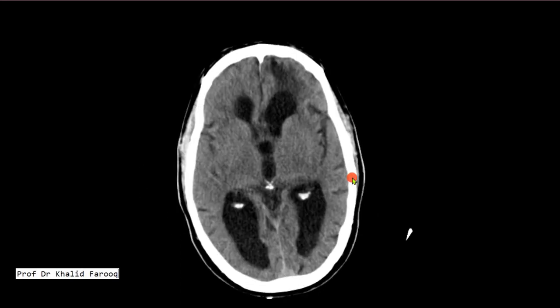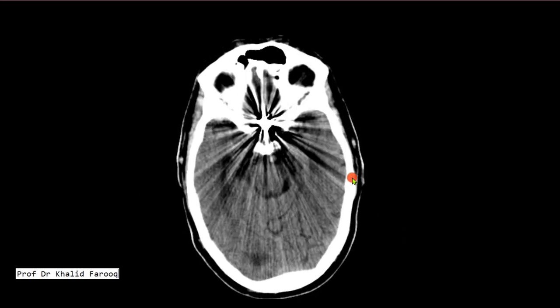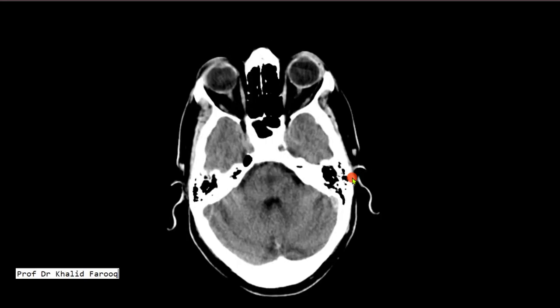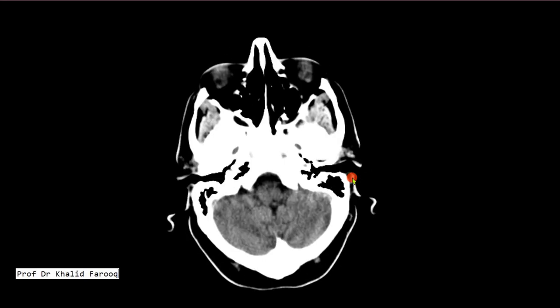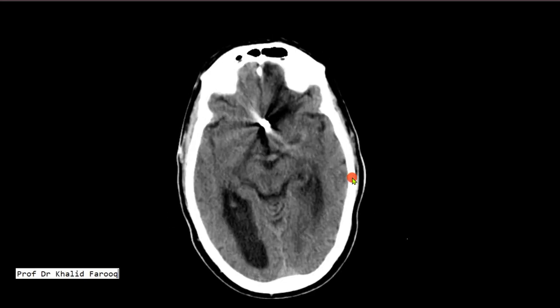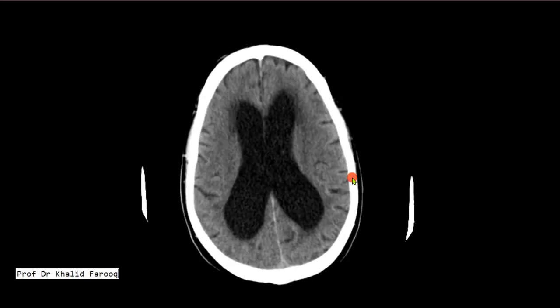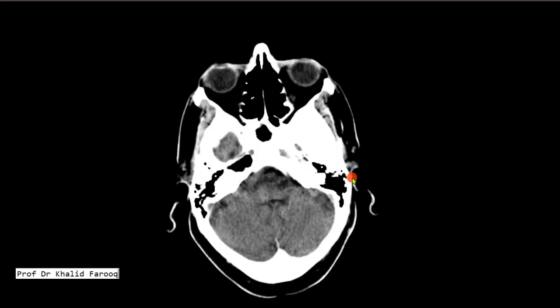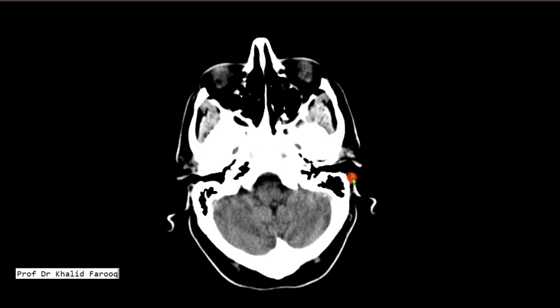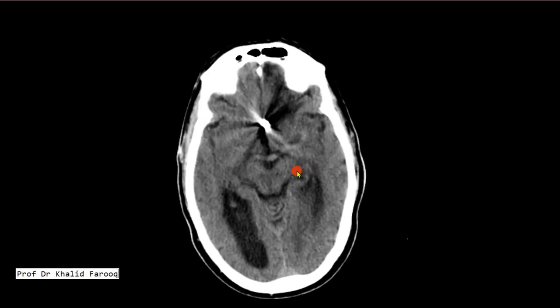Generally, there is no hemorrhage or mass lesion in this case. No midline shift noted. Here we can see the area showing the midbrain.